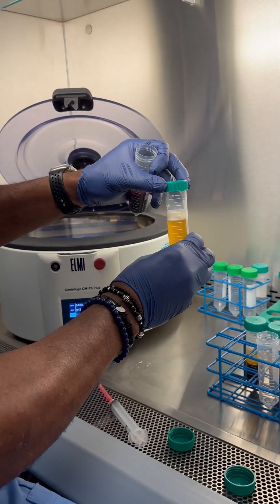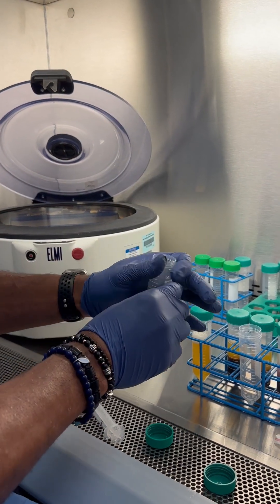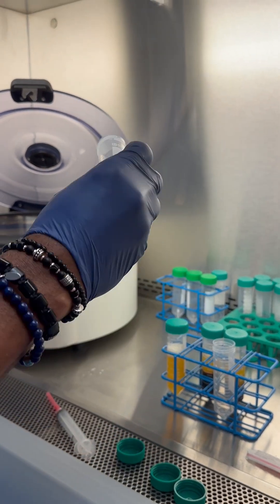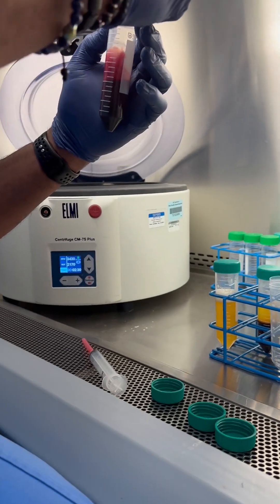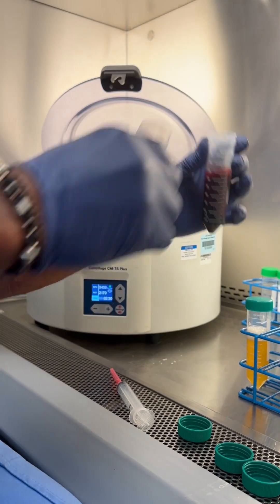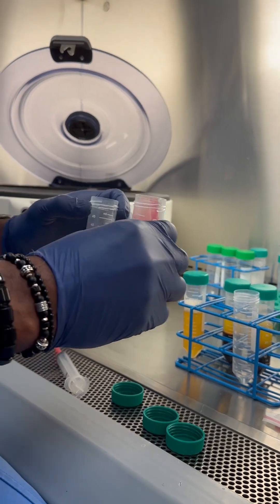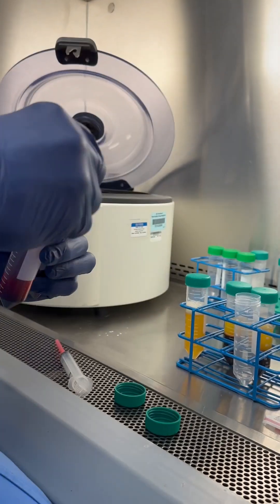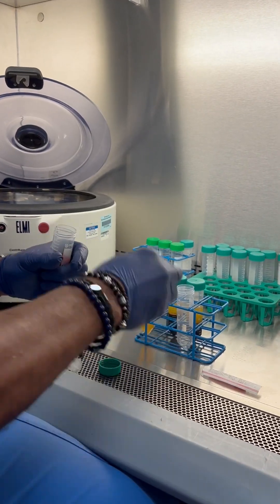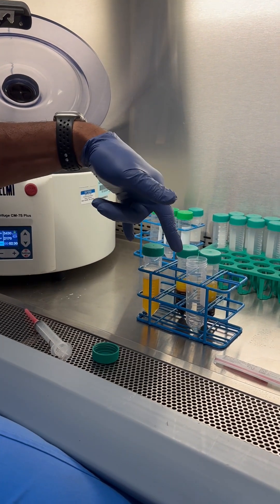If we were just doing 60cc, we would end up with about 30cc of plasma. For the counterbalance, I would take this and pour it in until we get to about 30cc — right about there — and that would be my counterbalance, and we would spin that for five minutes. Because we're doing 120cc, we're going to trash this because we'll be able to use the other 30cc of plasma as a counterbalance.